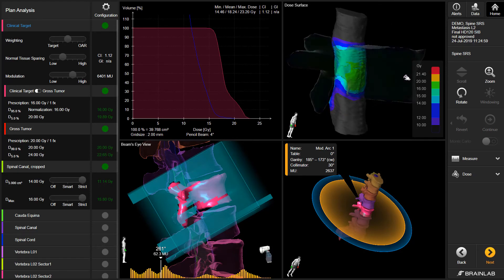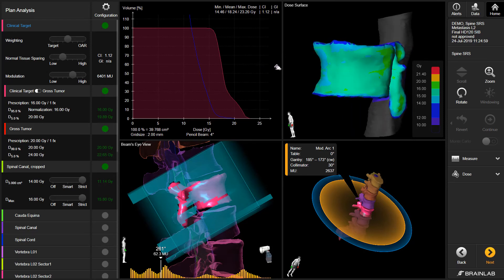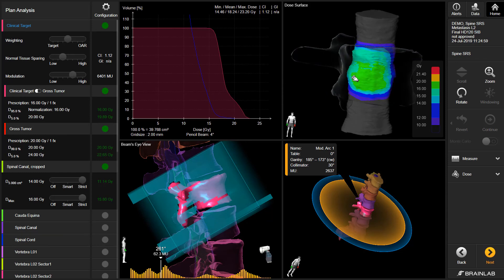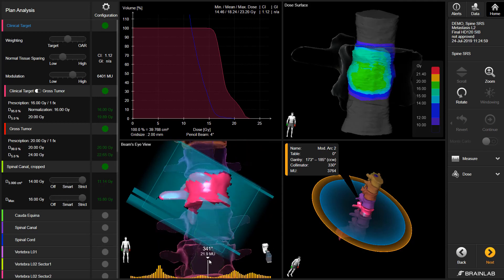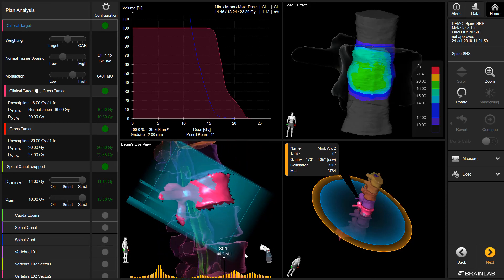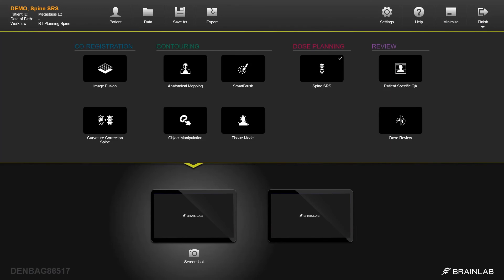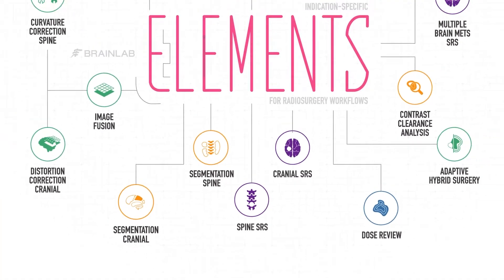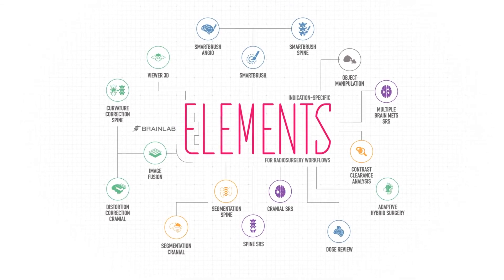These straightforward review possibilities, combined with an indication-specific optimization approach, result in a sophisticated spinal VMAT algorithm that can efficiently achieve superior plans. All that remains is to export to ExactTrack, which provides continual intrafractional monitoring with submillimetric delivery precision. The cutting-edge Element Spine SRS workflow enables exceptional planning and offers clinical efficiency for both treatment planning and delivery.